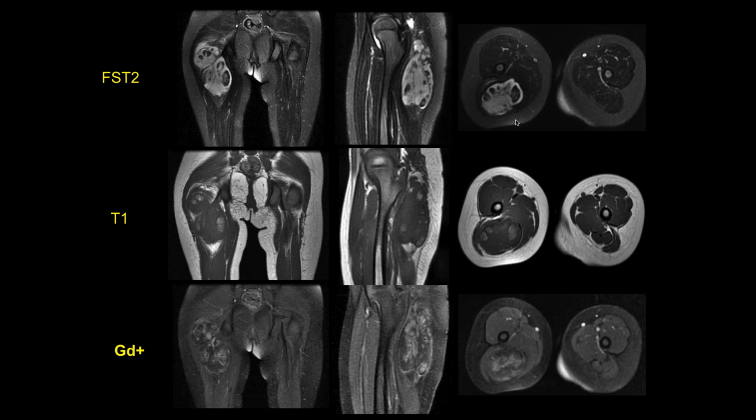Well, sometimes calcium can be bright on T1 as well, right? A milk of calcium can. The calcium itself is not what's bright, it's the substance around it. If you have an ossification, then it's the fat inside the ossification that's bright. If it's milk of calcium, it's more the fluid content that the calcium is in. The other thing is it could be some form of blood product that is high on T1.